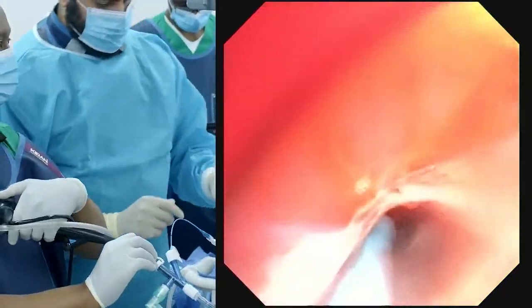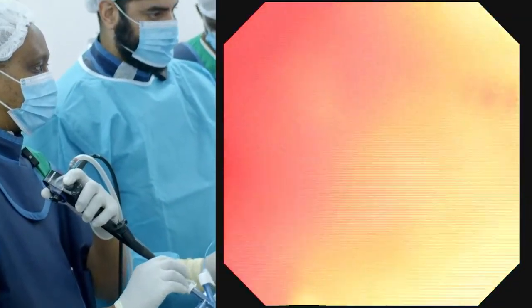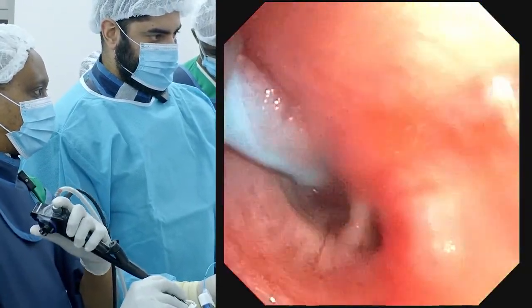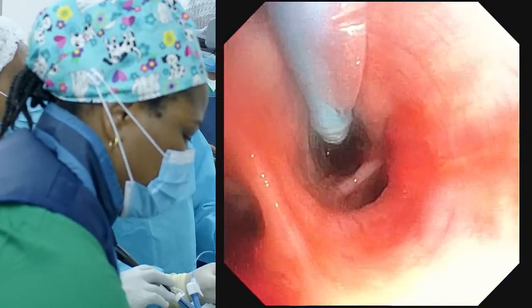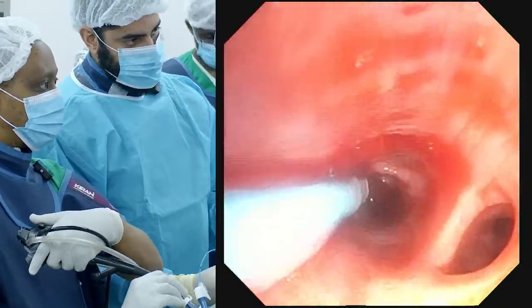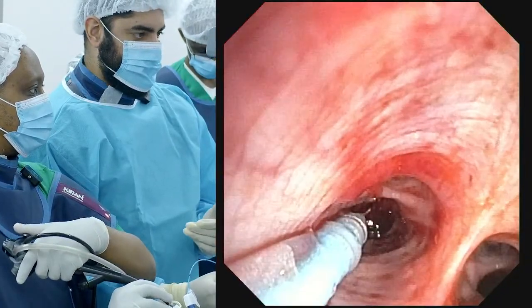Okay, when you're ready. I'm ready when you are. There's a small clot here, which is fine. You can do a 5-second freeze. Should be okay.